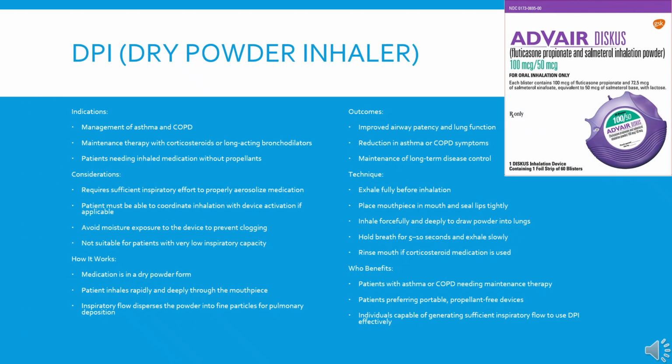DPI, or known as dry powder inhaler. Indications: management of asthma and COPD. A couple considerations: require sufficient inspiratory effort to properly aerosolize medication, and the patient must be able to coordinate inhalation with device activation if applicable.